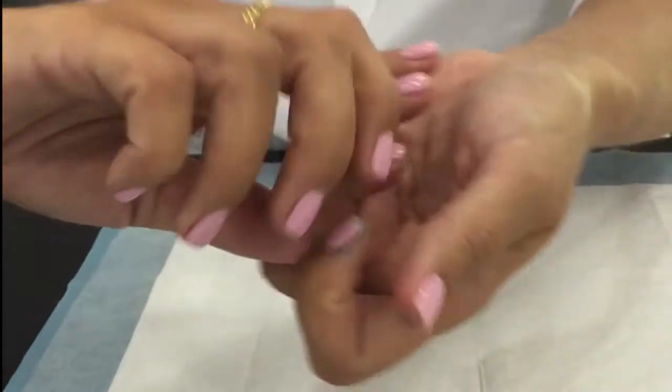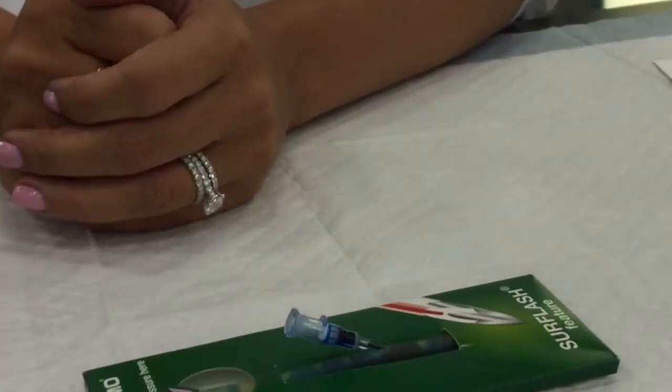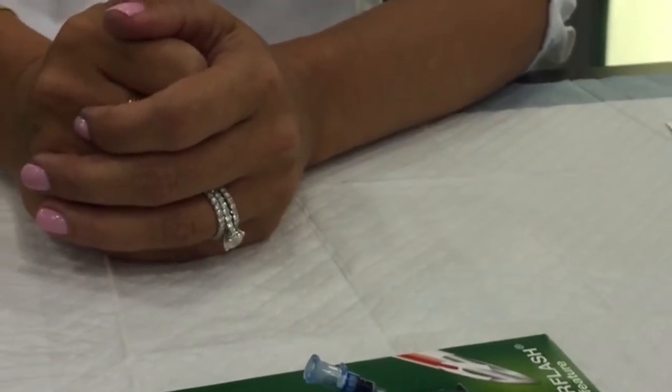At this point if you set up your admin set or a syringe, it's going to open up your valve. So it makes it easiest — with this you're going to reduce the blood exposure.